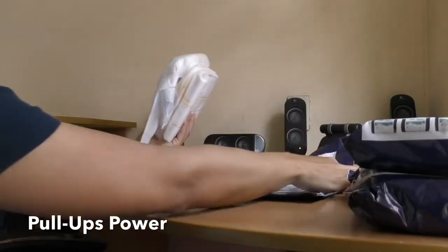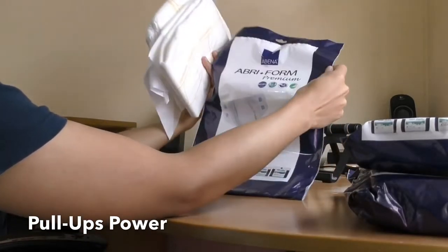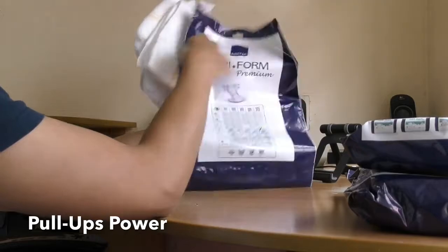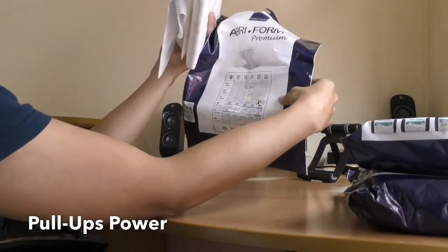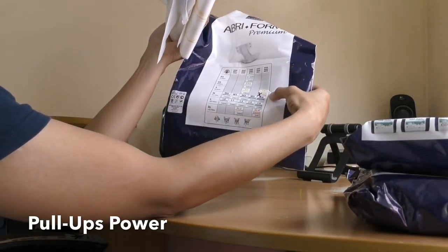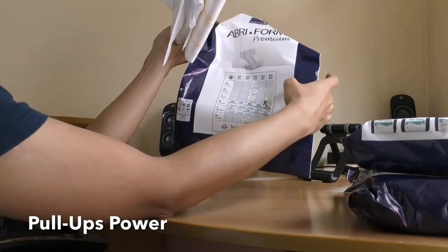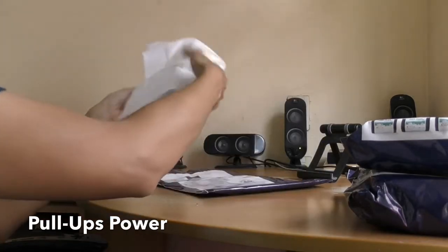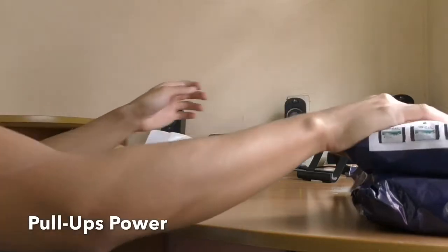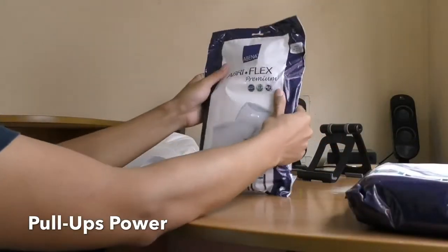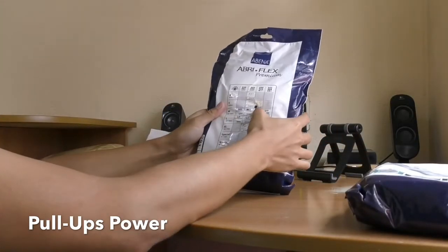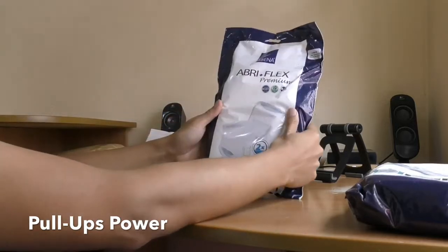So, let's take AbriFlex Premium S for small, level 4 absorbency. Let's go with another small, level 2 in absorbency.